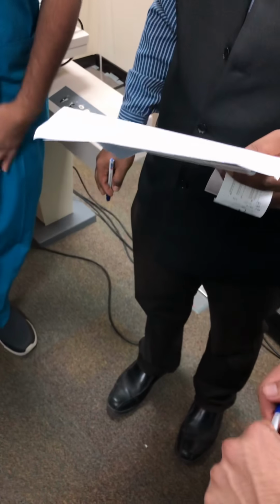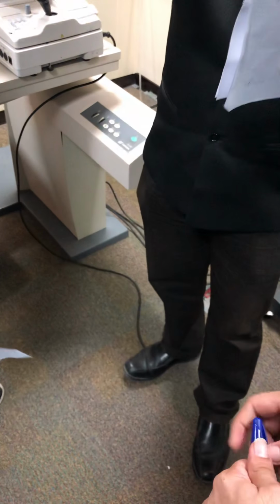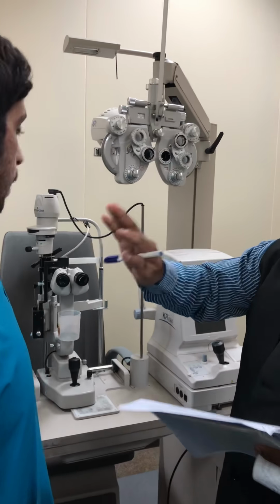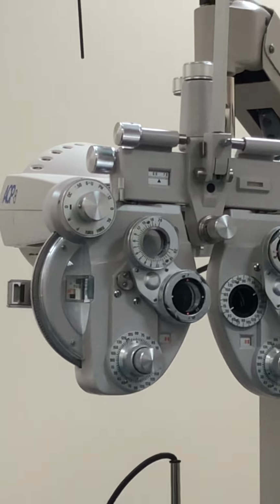Doctor, what about the binocular balance with prism? You just keep a prism here, up and down. Keep 6 prism base up after all the other steps, and he will see one chart on the top and one chart down.